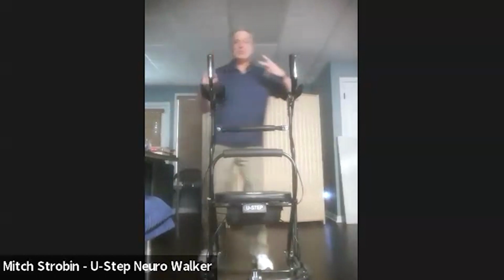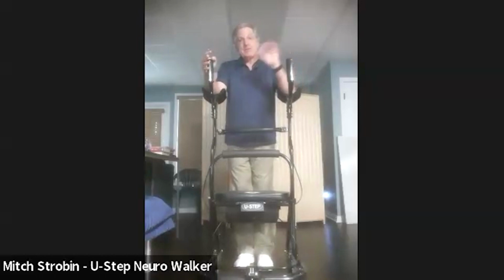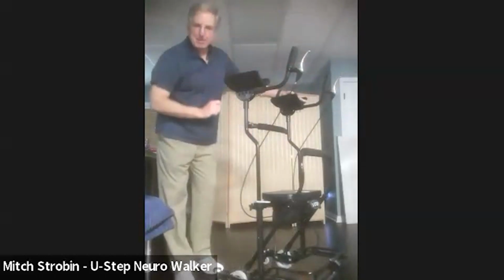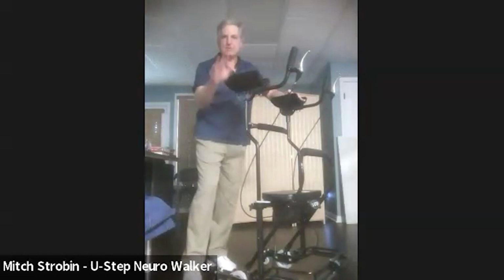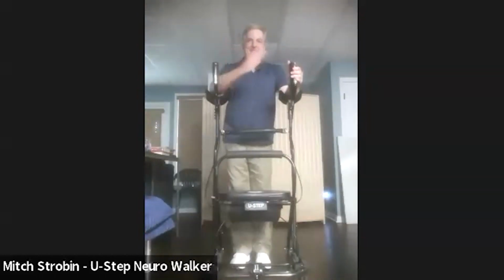Now, what's also nice is that there's two sizes of the platform. There is what's called the short for individuals 5 foot to 5'9", and tall for individuals 5'7" to 6'4". In addition, what's also nice about the platform, and I know maybe a little challenge to see, but there's columns of holes and a row of holes, and this is all about arm positioning, whatever is most comfortable for you. So you can do your standard 90 degrees, but you can angle up, you can angle your arm down, and you can probably guess where I'm going here. We can angle our arm in, angle arm out, whatever makes the most sense and is the most comfortable.